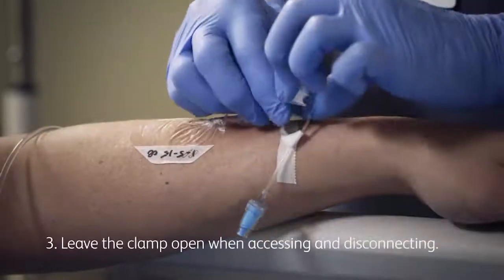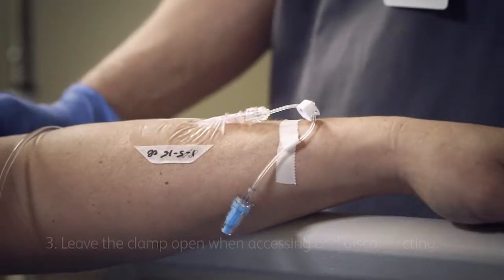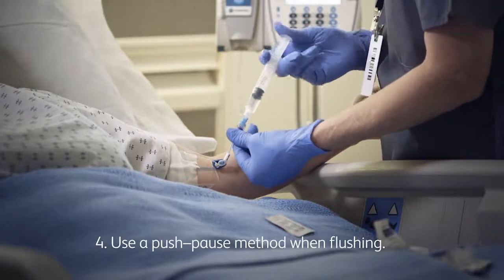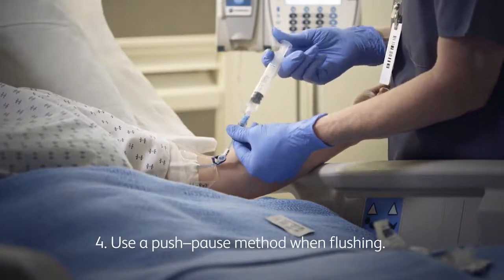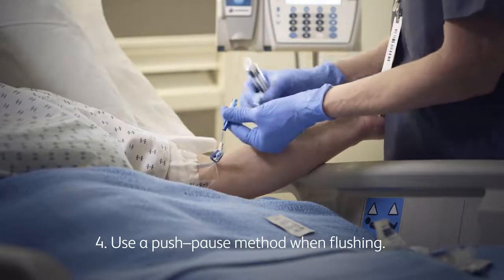Three: Leave clamp open when accessing and disconnecting. Only clamp for safety. Four: Use a push-pause method when flushing. Remember, the MAC-Zero has been tested for an 8-day change-out policy, but follow your own hospital's protocol.